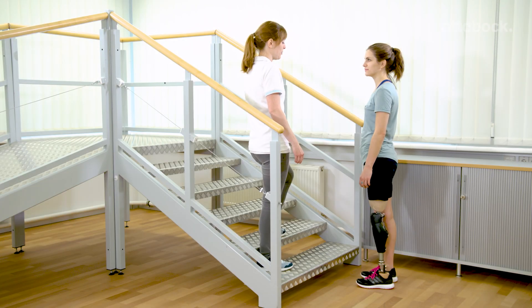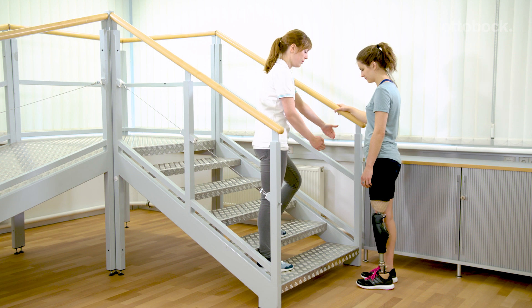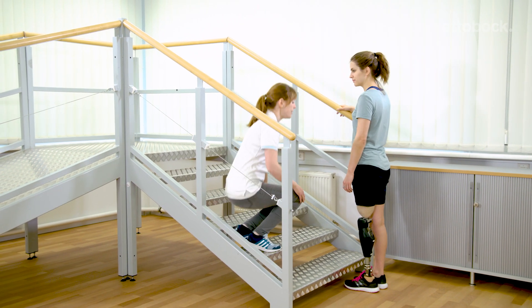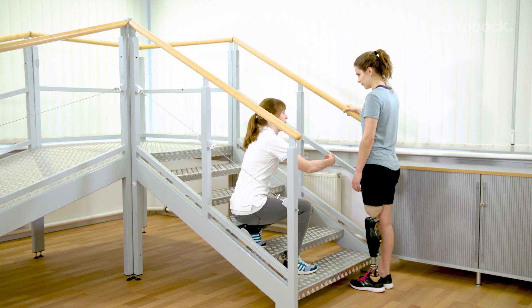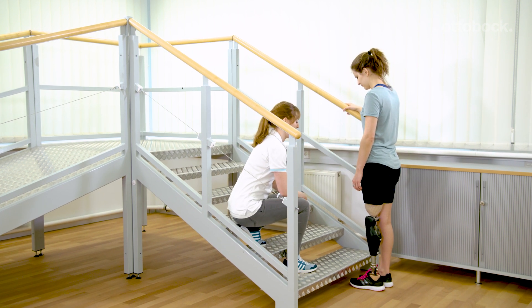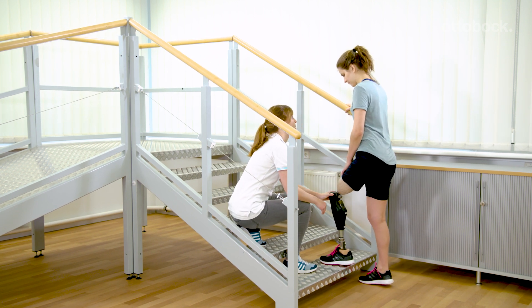The fundamental exercises for stairs and obstacle function are put into practice. Triggering the function, foot placement, and finally stepping up. Start on the contralateral handrail as this provides the best support. Franziska supports foot placement and hip extension.